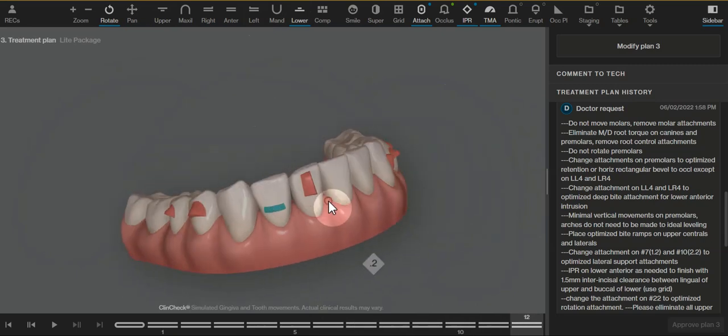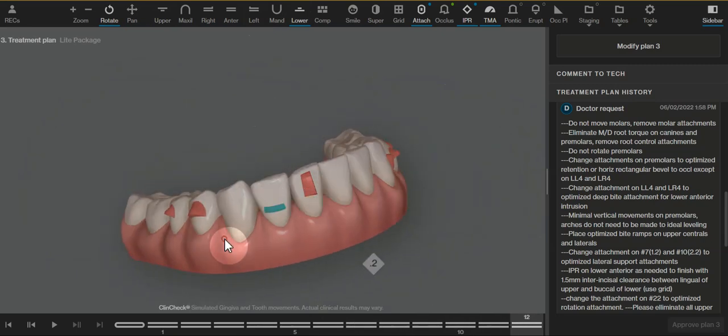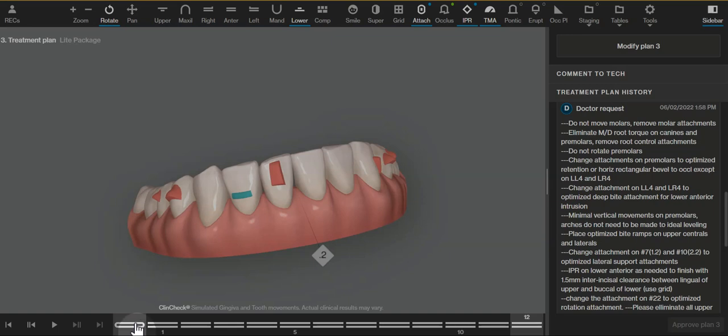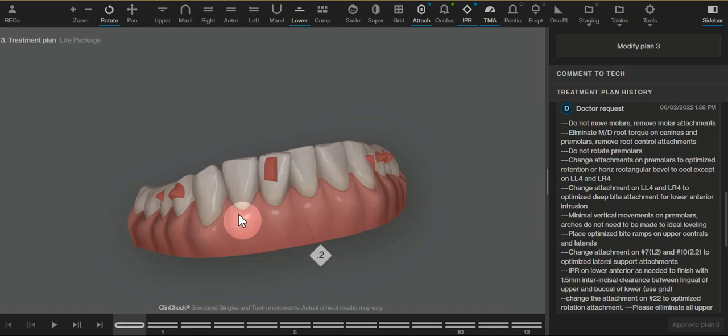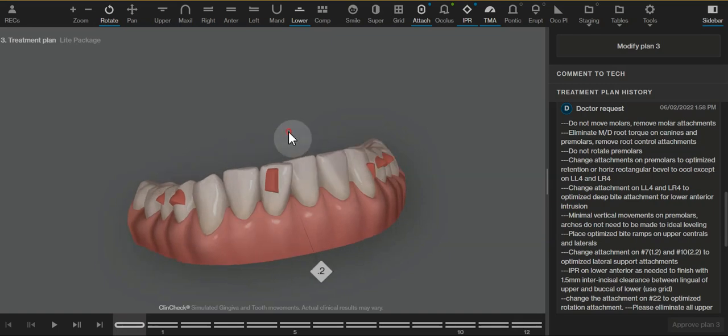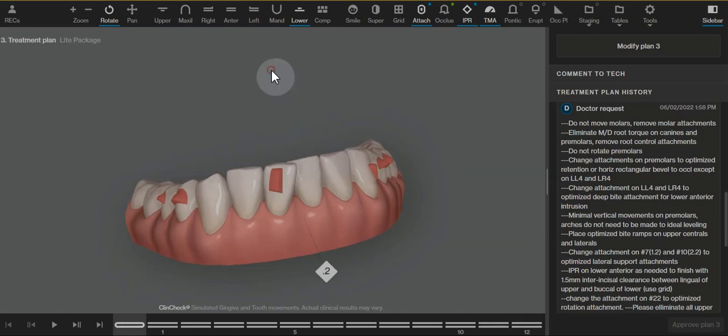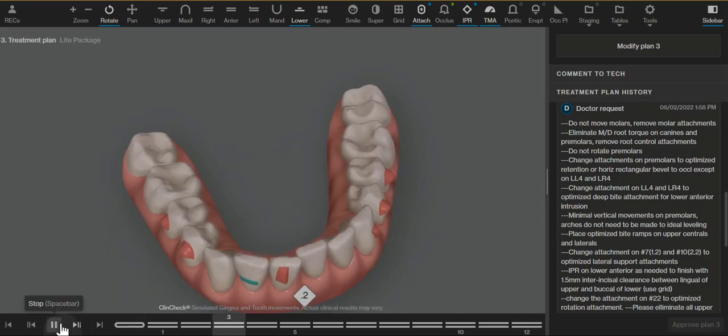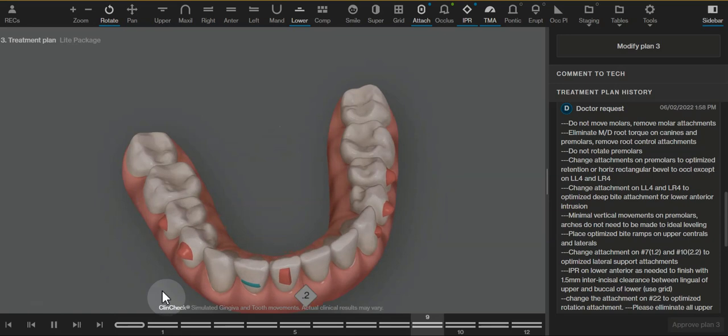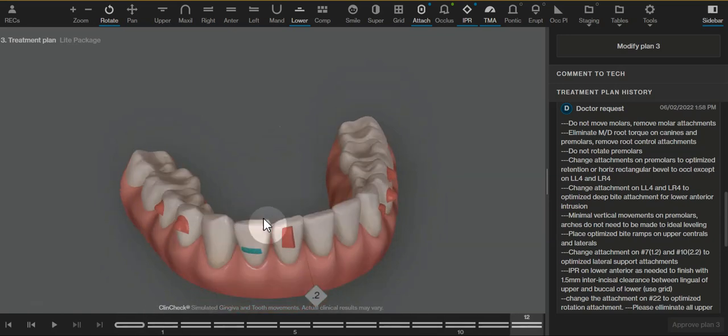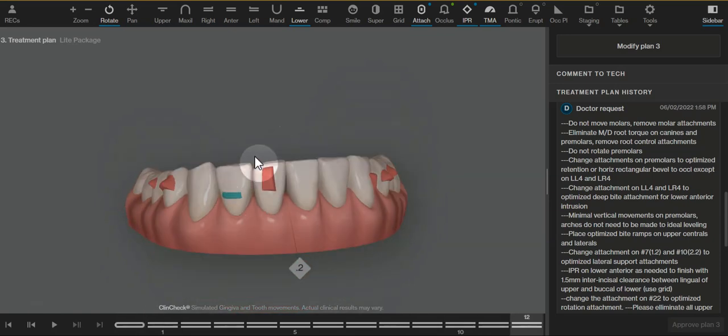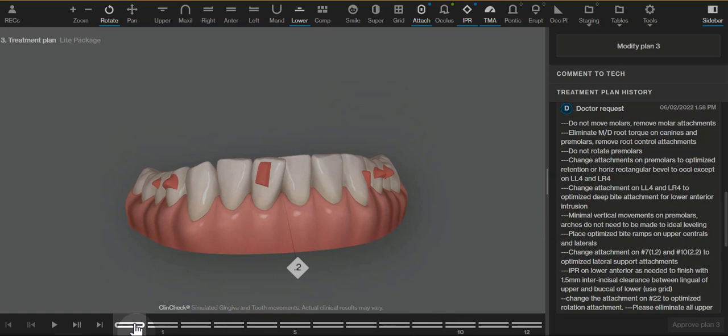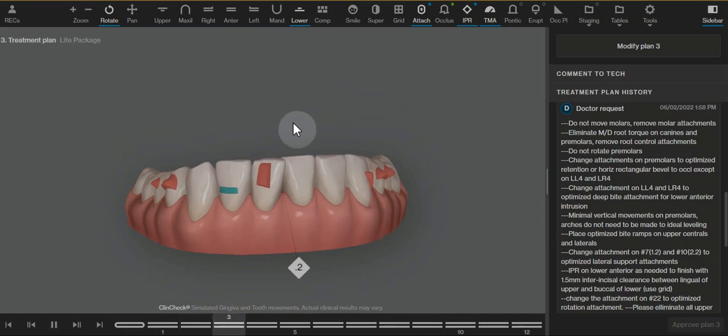An attachment that you don't see all the time is this rectangular attachment for the lower anterior. If we were just looking from the occlusal view and trying to rotate this tooth, you would think that no attachment would be needed. However, because this root starts off leaning towards the distal, and in order to get it into a vertical position, we're trying to do mesiodistal root torque as well as rotation to get this upright.